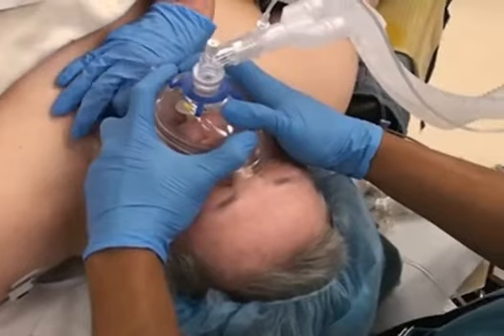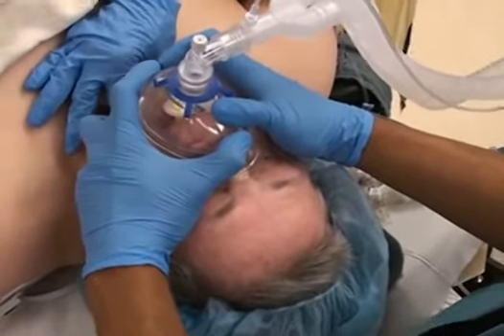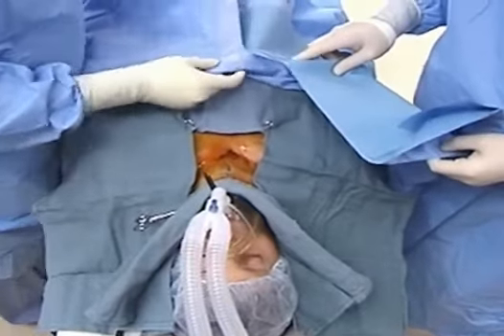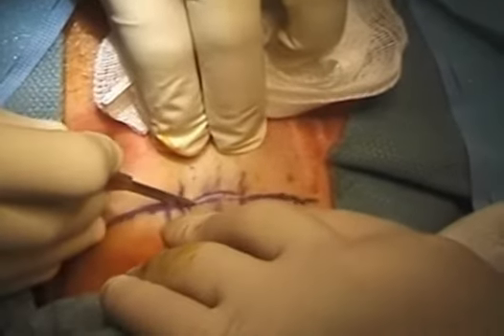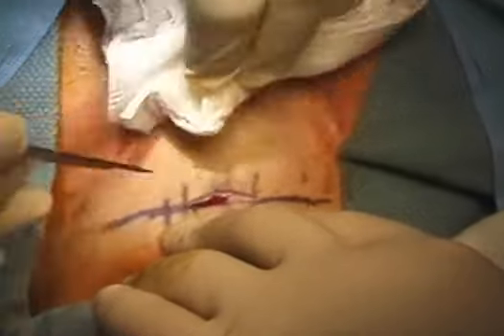In the rare event that it is not possible to ventilate or reintubate the patient after extubation, it may be necessary to establish emergency airway access by performing a cricothyroidotomy. Thus, you should make sure that the equipment and personnel needed to perform a cricothyroidotomy are available.